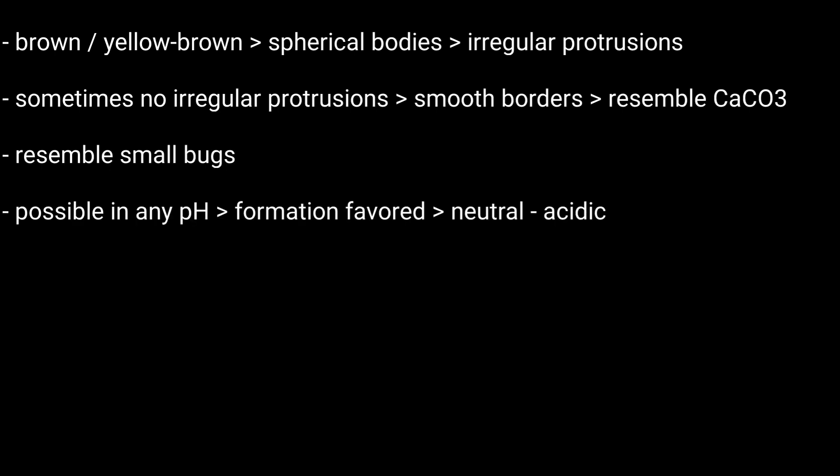Though possible in urine of any pH, their formation is favored in neutral to acidic urine. They are frequently seen with amorphous urates.